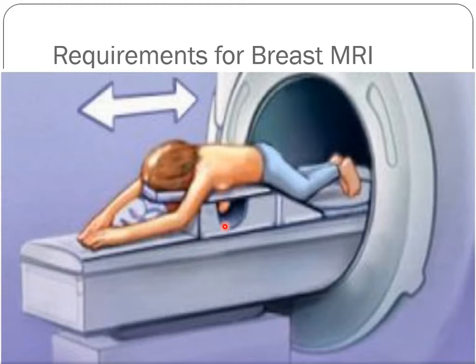Another limitation is pregnant women. You cannot make someone who's 7 or 8 months pregnant do this position and go in the machine. So this is kind of a problem. And third thing, when we put the patient in this position, head first, the patient should always have a cannula in the hand for contrast administration. Because when she's prone inside the machine, her hands will be showing from the opposite side, so you can give contrast from the opposite side in the cannula. Don't forget the cannula before the patient is in the machine.